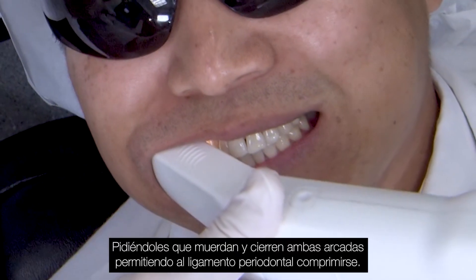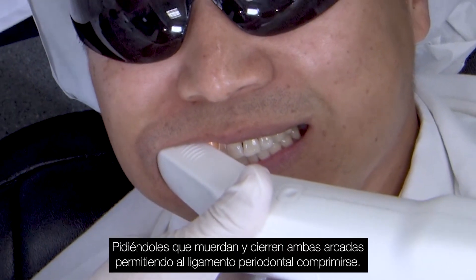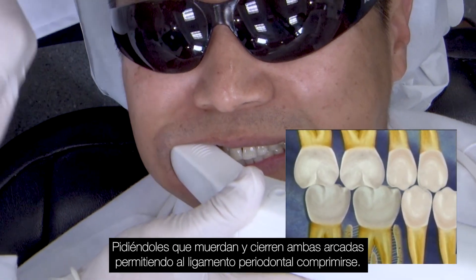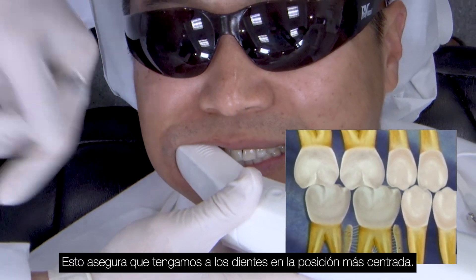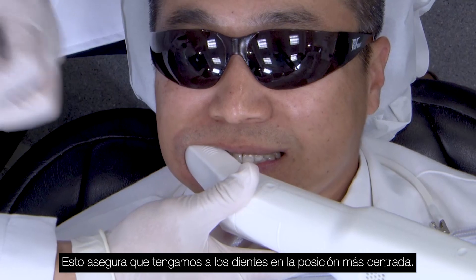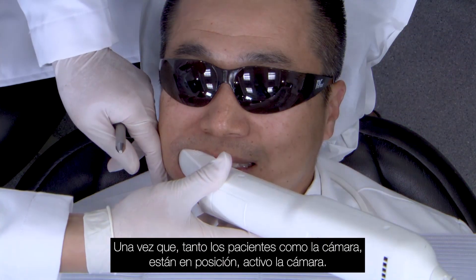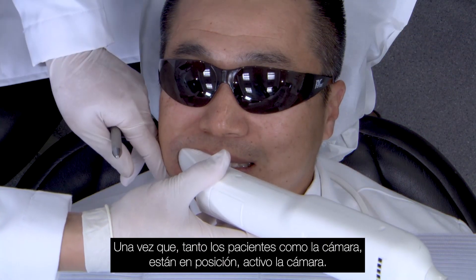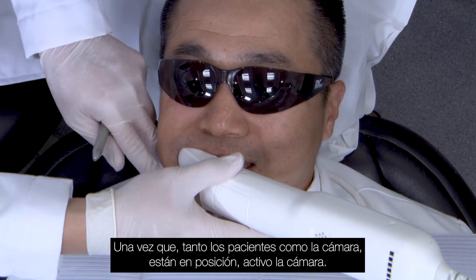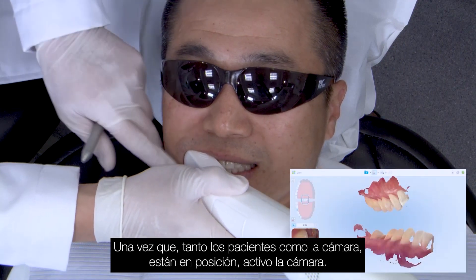We ask the patient to bite down and just clench together, and that allows the PDL to compress — it really ensures that we have the teeth in the most centric position. Once they're in that position and the camera's in position, I'll activate the camera.